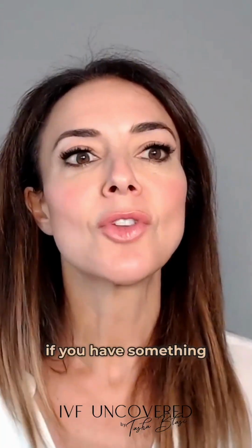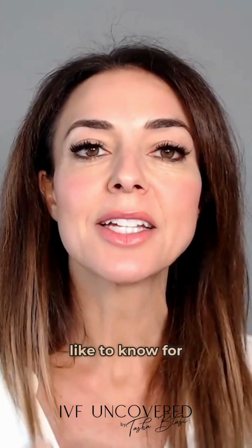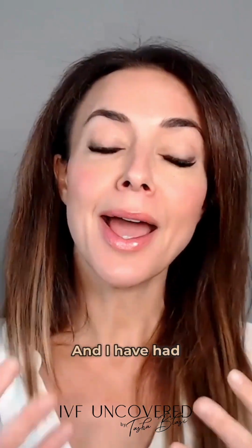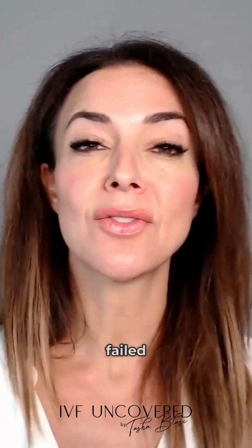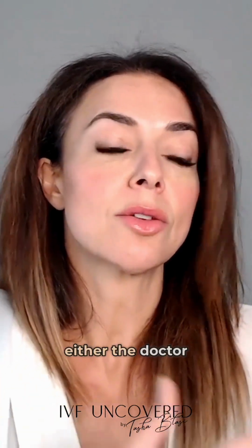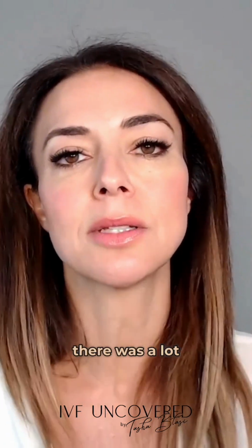So if you have something big like a polyp, that tends to show up on both. But again, I like to know for sure that nothing is going to block implantation. And I have had clients where they've had failed transfers, and I'm like, get a hysteroscopy. And the doctor's like, I won't do it. And finally, either the doctor agrees eventually, or they go to another provider. And unfortunately, there was a lot of scar tissue.